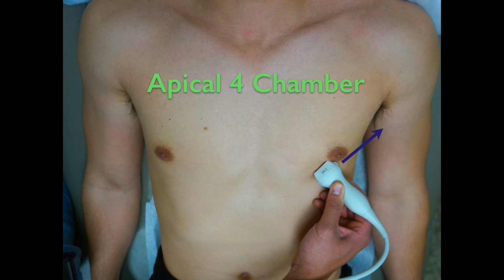So the third view is going to be the apical four-chamber view, and a lot of times this is one of the most difficult views to obtain for novice sonographers, but we'll show you a way that makes it a lot easier to get. So for the apical four-chamber view, the indicator is still going to be towards the left side of the patient. However, you just slide it down where the apex is and just tilt it, and you should be able to get the apical four-chamber.